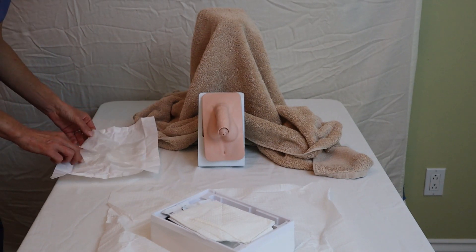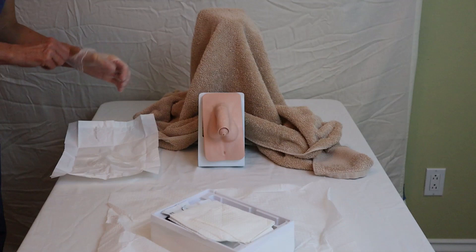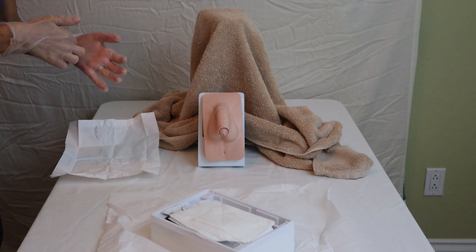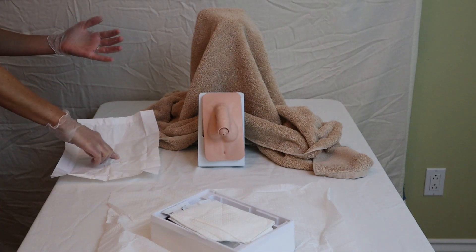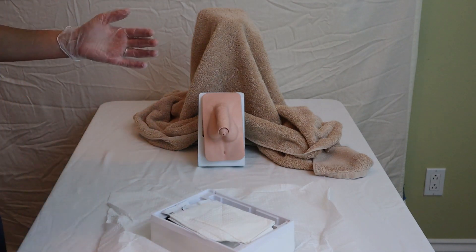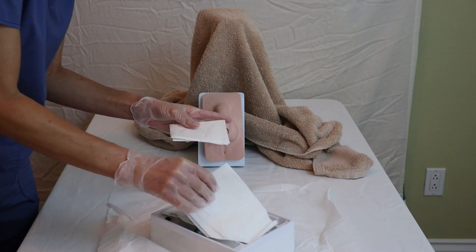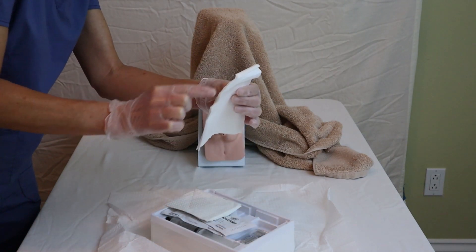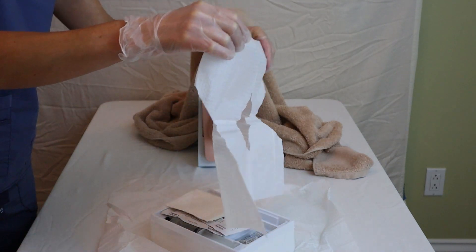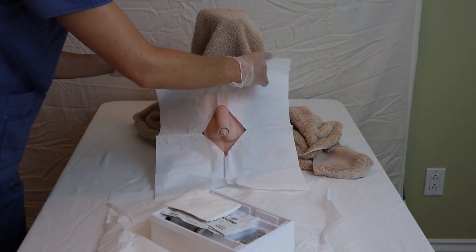I don my sterile gloves being careful not to contaminate anything. The wrapper of the gloves on the inside is sterile, so I can grab it with my sterile gloves and toss it. Each catheter kit comes with a sterile towel and also what's called a fenestrated towel, which has an opening in the front. I like to use it because it allows me to expand my sterile field by draping it over the patient's genitalia.